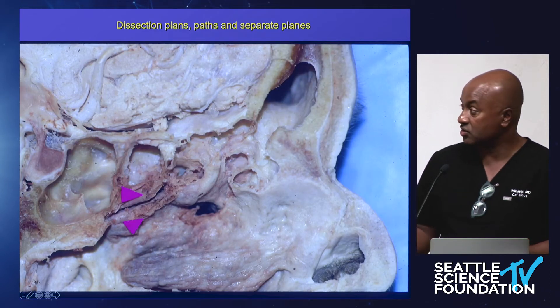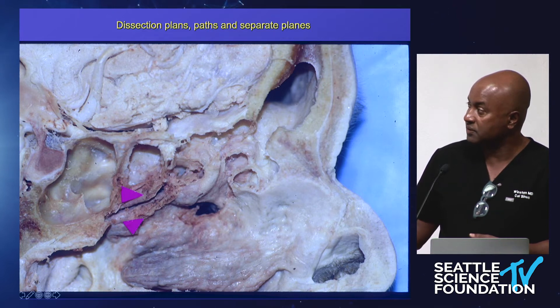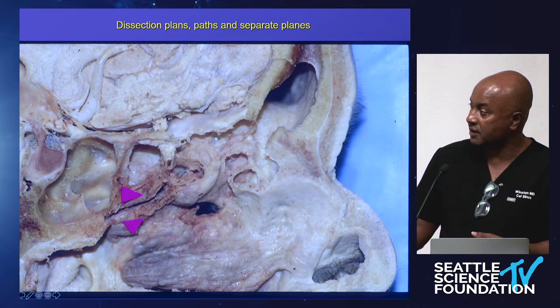Here is the cross-sectional anatomy. Coming in, we can see the inferior turbinate and the ethmoid bulla. The uncinectomy has been completed. The goal is to reach behind the ethmoid bulla into the retrobulla recess and pull it forward. After doing that, you have your basal lamella, superior turbinate, and sphenoethmoidal recess. As you enter the posterior ethmoids over the basal lamella of the middle turbinate, using a zero-degree scope points you in the wrong direction.